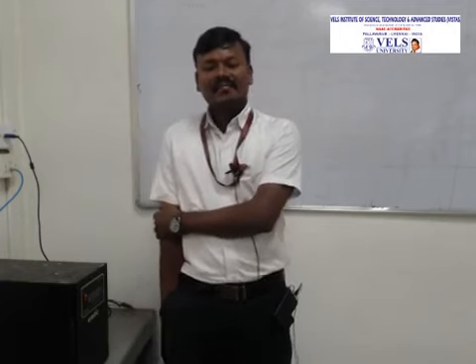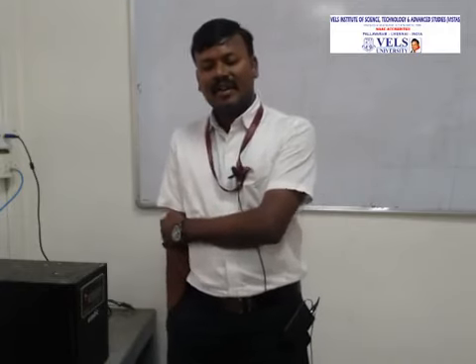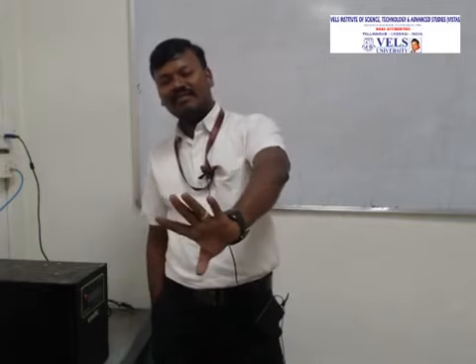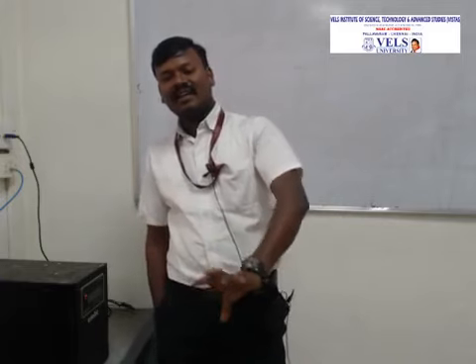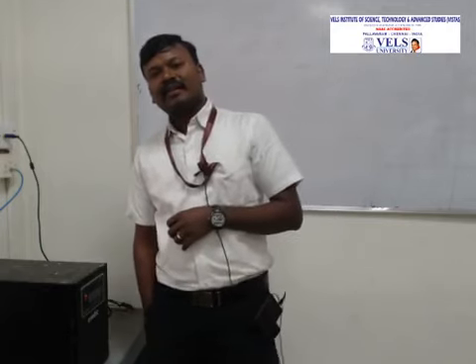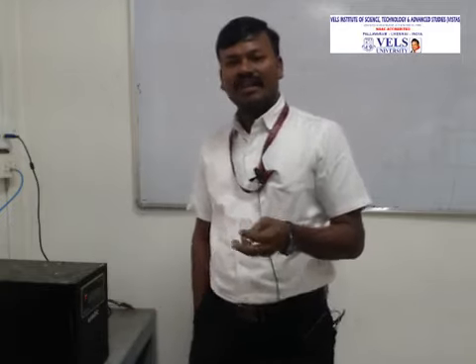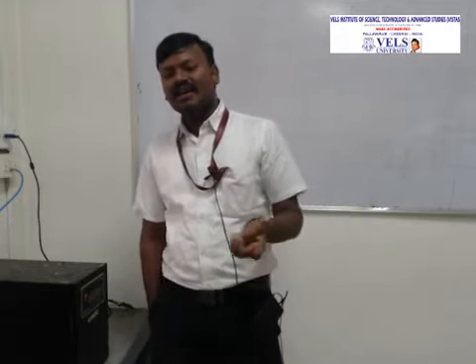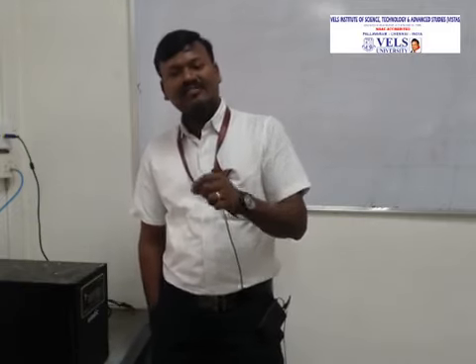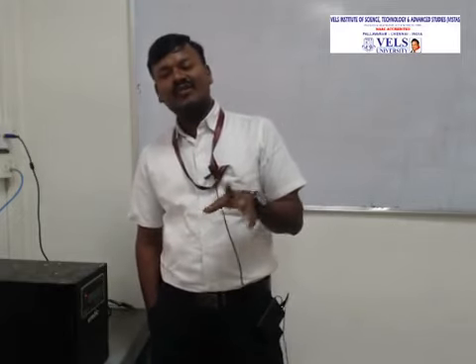See that the embryo is held with gentle suction using a glass pipette. So we have the region. I think you might have seen that you can easily hold the embryo in place, which is easy with the help of a laser or needle. The red pilot light provides a visual target for the laser. That is the region we have to target. The white circle marks the safety region based on the temperature.